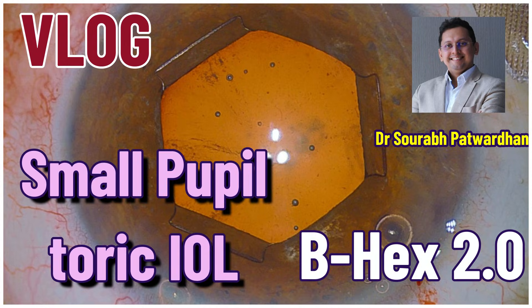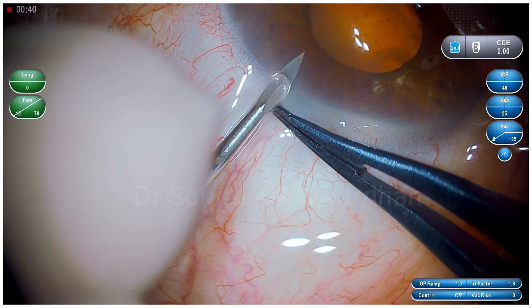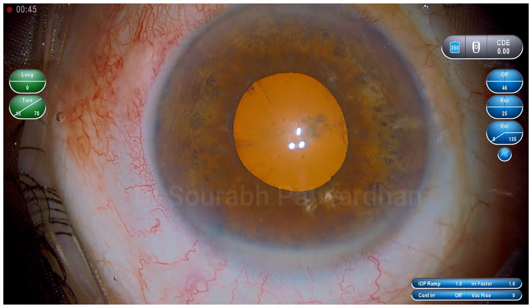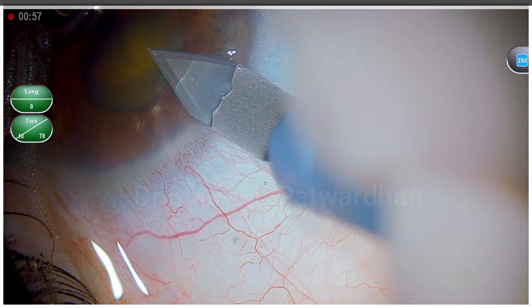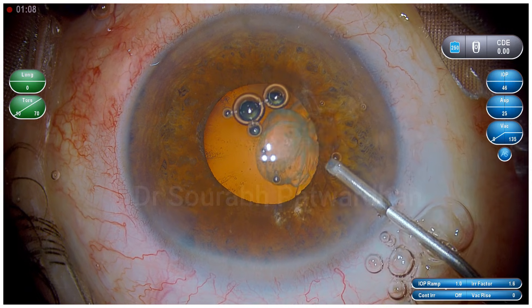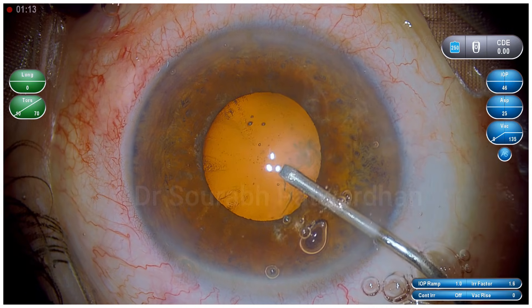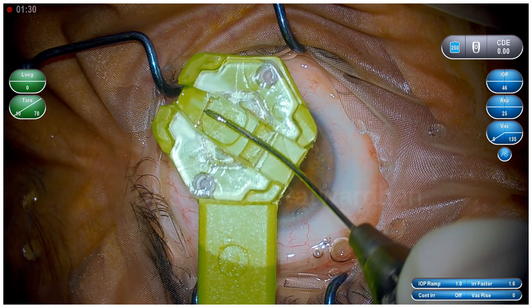I am going to use a Bhex 2.0, which is a pupil expansion device by Dr. Suven Bhattacharji — it's an excellent tool to have in your OR. This is a small pupil patient with a shallow anterior chamber as well. This is a diabetic patient and laser has already been done for the retina. After initial incision I have used Hyalucoat to make sure the endothelium is very well protected.